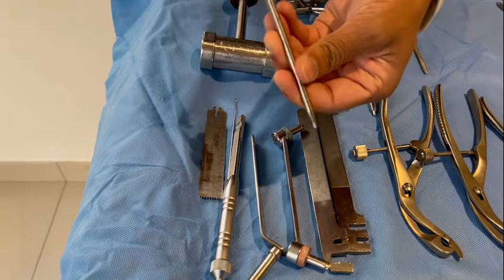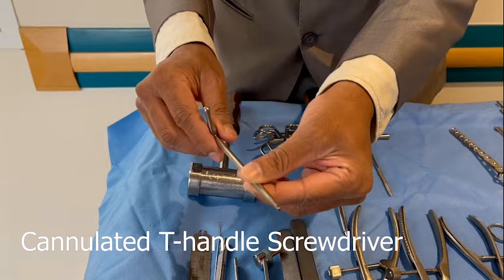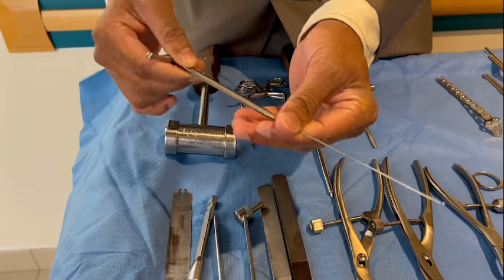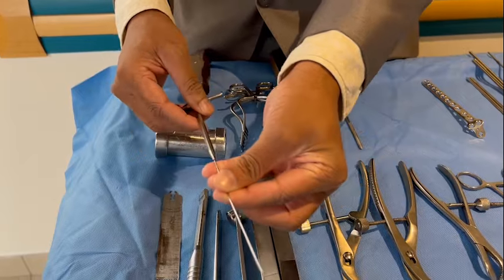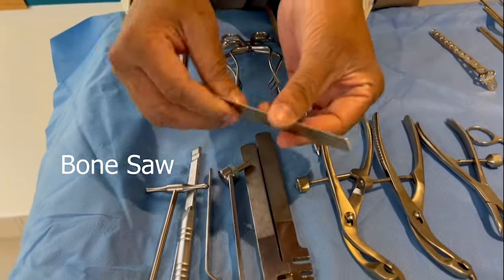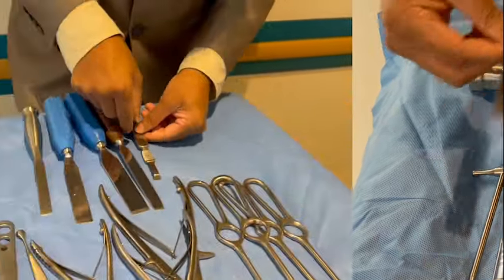This is a cannulated T-handle shaped screwdriver. It goes with a thin K-wire, which is a guide wire. This is a bone saw, used along with the electric saw.